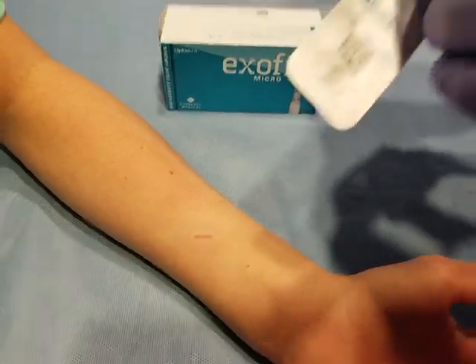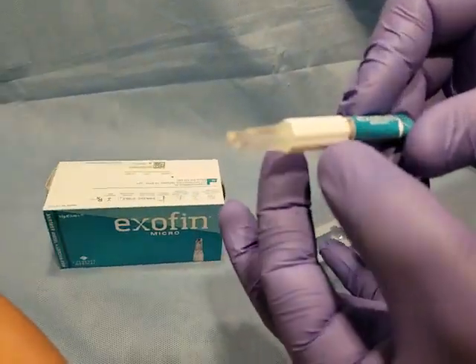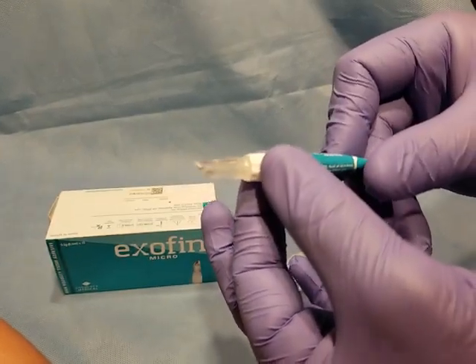Once you get that clean and dry, we're going to open our Exofin and take it out. This one has an accelerant cap inside of it, so you don't screw it down until you're ready to use it.